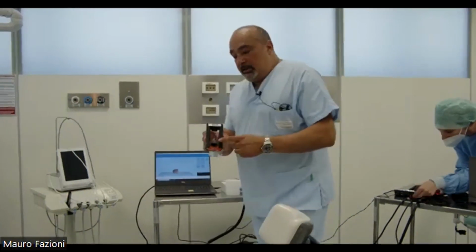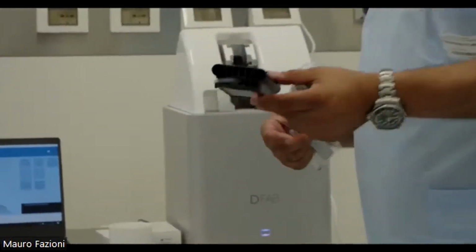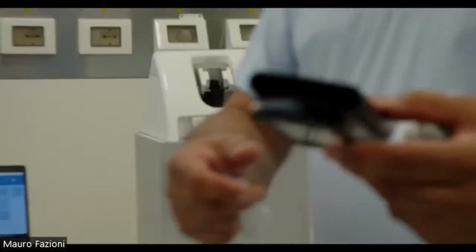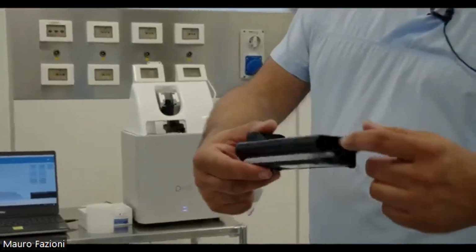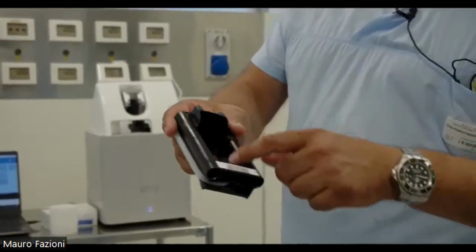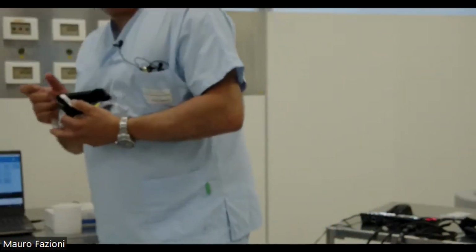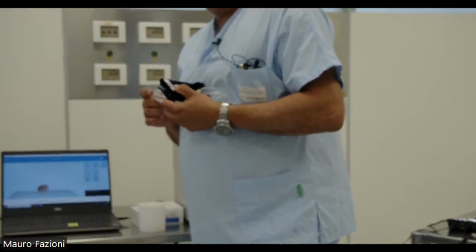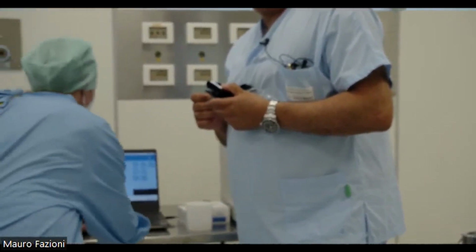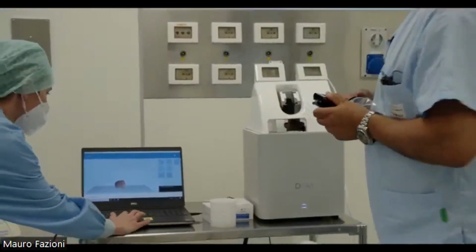Here you can see the two material we can set, okay, if you want. Here they will be squeezed into the plate, okay, and here there is the crown. We can set 5 or 6 crowns together into the same printed section, okay.